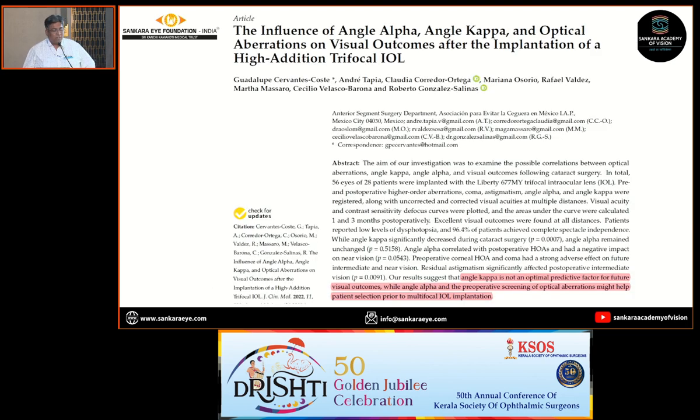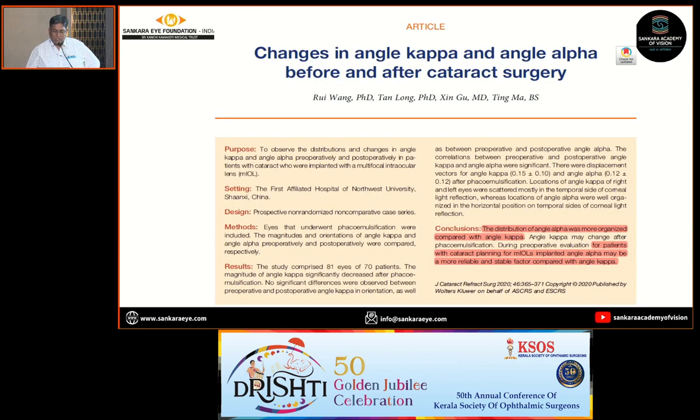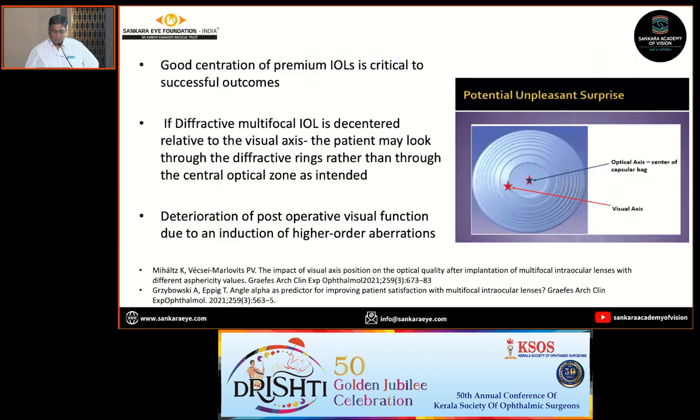Now, in this study, where they looked at the influence of angle alpha and angle kappa on the visual outcome following implantation of a trifocal lens, it was clearly seen that angle kappa is not a positive predictor, but angle alpha is what is required as a preoperative screening tool before we implant these multifocal IOLs. And this is also another study which tried to prove the same thing.